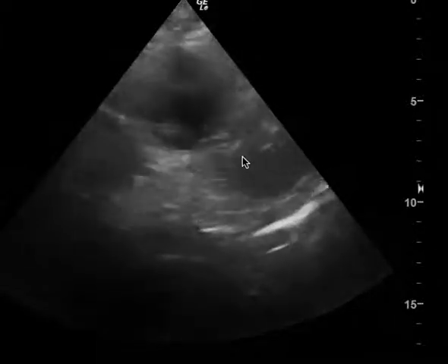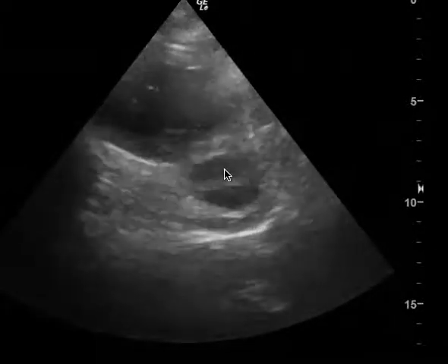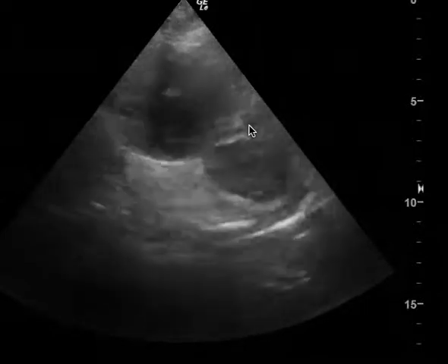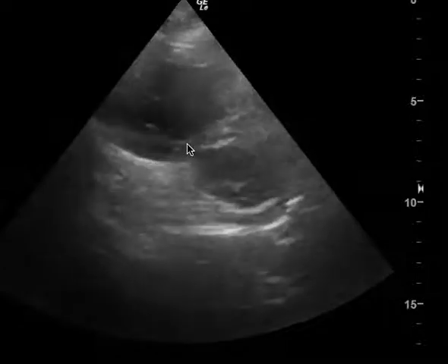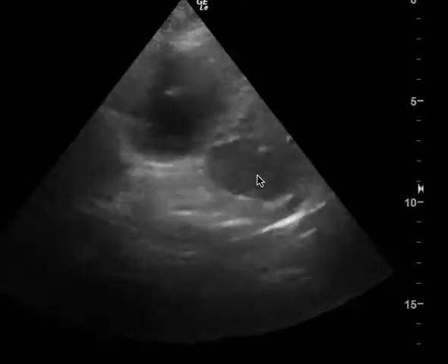This is a cardiac ultrasound. This is the left ventricle. This is the right ventricle. This is the parasternal short view. Normally the LV should be bigger than the right, but here, just by looking at the clip, you can see that the right is much larger than the left.